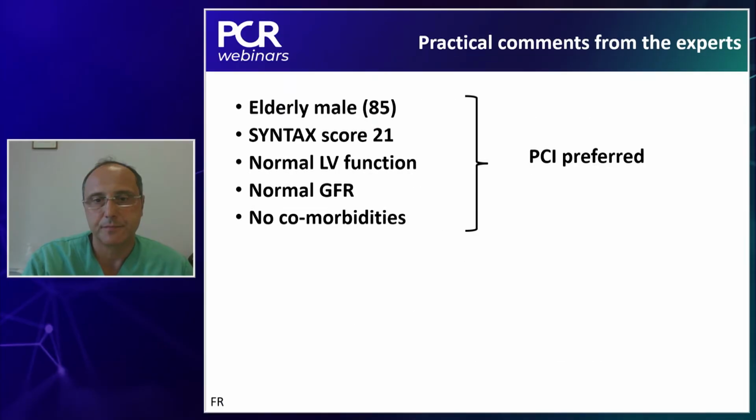Okay, I have other comments and questions, Flavio, that we can address while going through the case. So if we go back to the slide, perhaps.